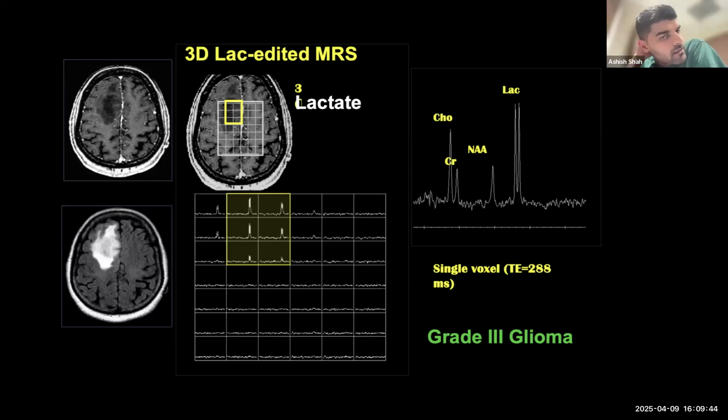What are your thoughts on this new 3D MR spectroscopy, whole brain MR spectroscopy, and its utility as we're moving forward? Yes. So again, the pros and cons: the advantage is you cover a larger volume. Another advantage is tumor is heterogeneous. It's not like you get one piece of information that averages the tumor and gives you the answer. So the 3D spectroscopy from that perspective is very helpful.